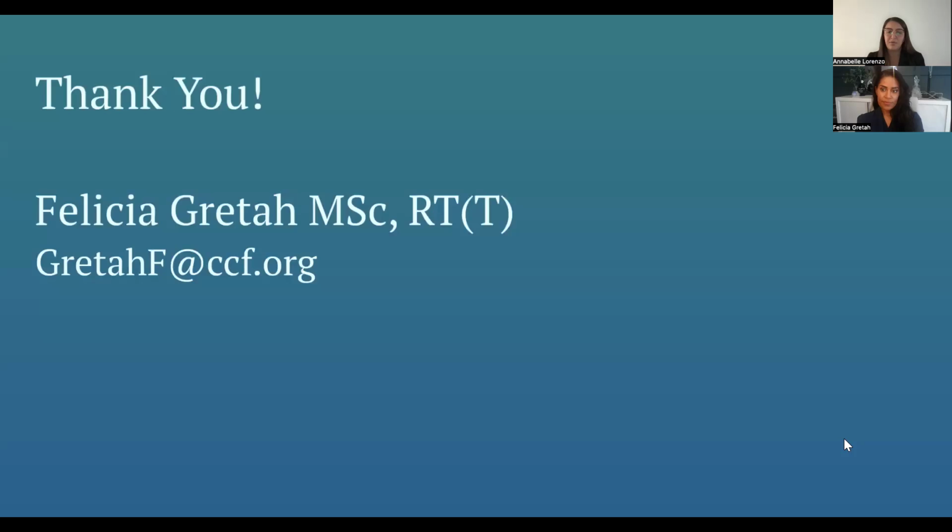That's a very interesting approach. I think most of the hospitals that I've been working with are actually using the percentage button in the SDX software. So you're taking it in reverse. You're asking the patient to stay comfortable so you don't have to decrease it yourself. Interesting.